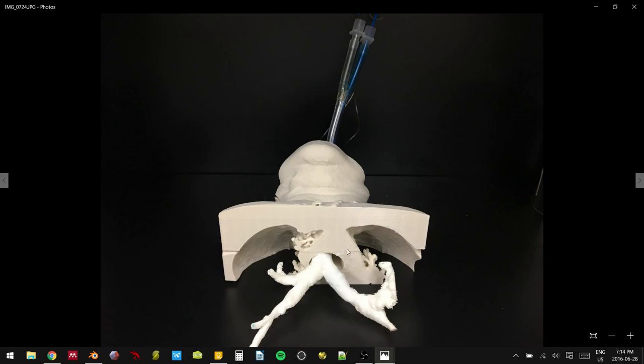In total, you'd want to do this because the raw material cost involved is basically negligible. So if we ignore this airway holder here, which is fairly large but still kind of cheap, I don't exactly know how much this would cost, but anyway, the simulator that we just printed with the NinjaFlex costs less than $10. I'd hazard a guess that it's worth less than $5 in the materials that it's printed with.